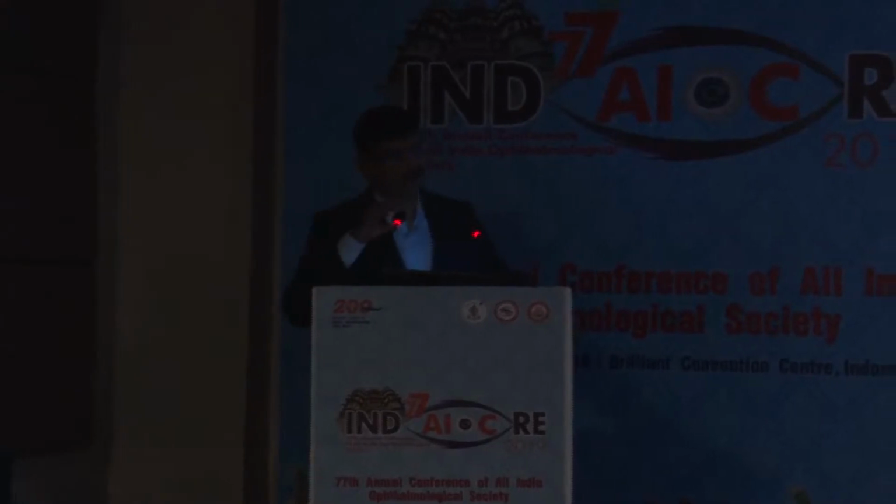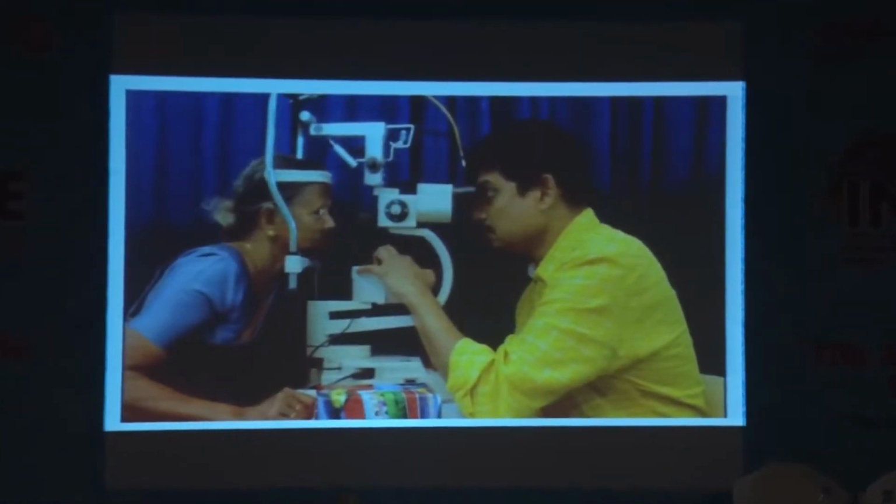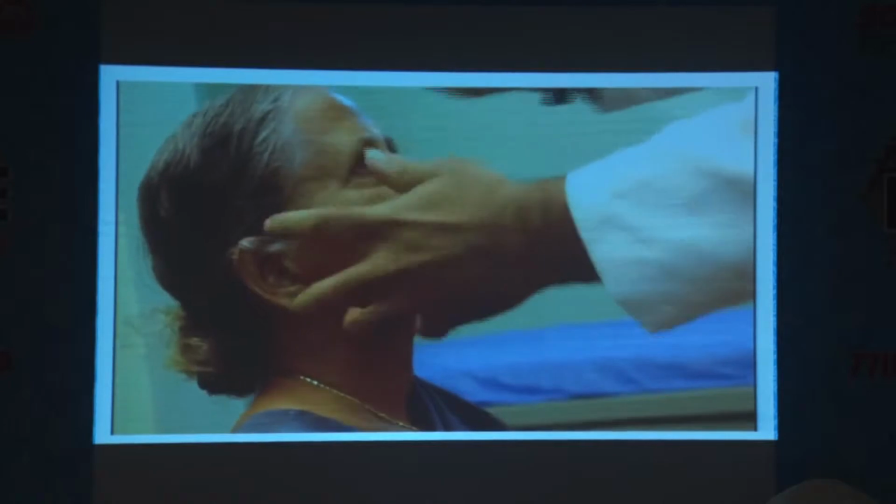So it is a little different from the technique that is used in the Western world. For us, the patient is examined on the day of injection to rule out any source of infection. Once it is okay to inject, topical anesthetic followed by 5% povidone iodine drop is instilled in the eye. The patient is then shifted to the OR after taking an informed consent.